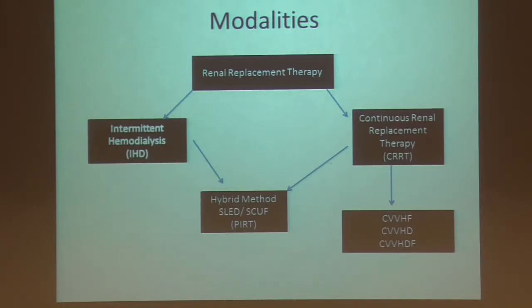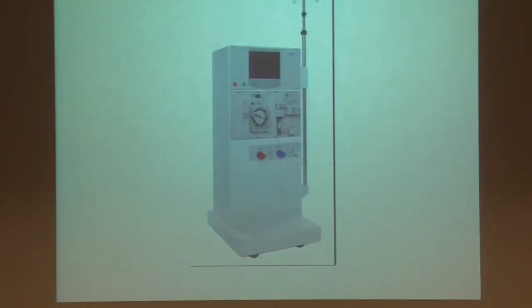And that's kind of how you come up with a prescription, like, all right, let's take a liter off in 12 hours. Obviously, it's much more gentle than trying to take a liter off in an hour, right? So that's essentially it: look at the patient, how much you want to take off, what the labs are, and I'll show you the settings later.